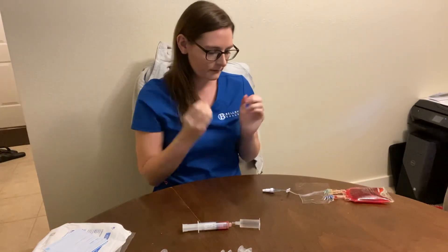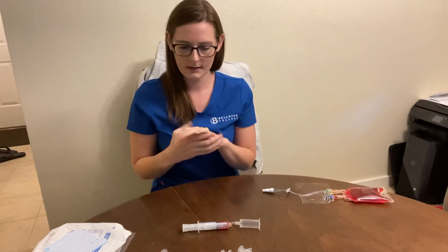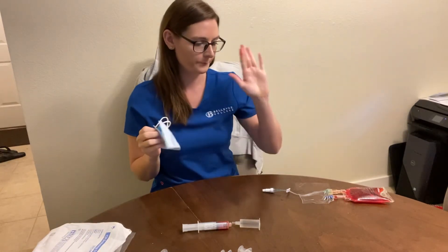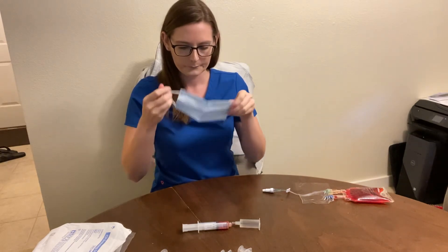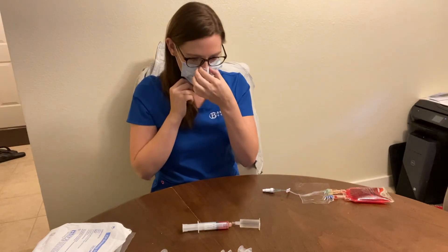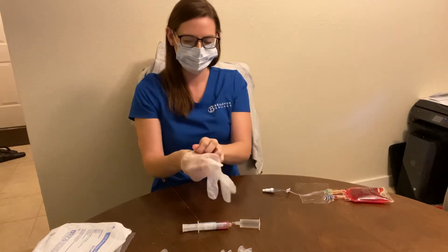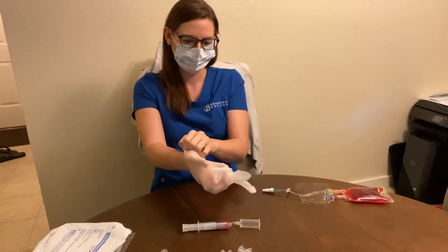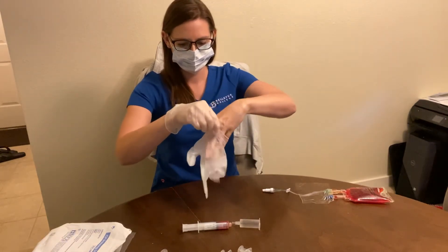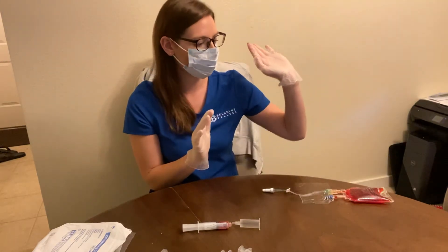Now we're going to do the dressing change. I'm going to come in, wash my hands, get a mask on, and give one to my patient as well. Then I'm going to wash my hands and put gloves on.